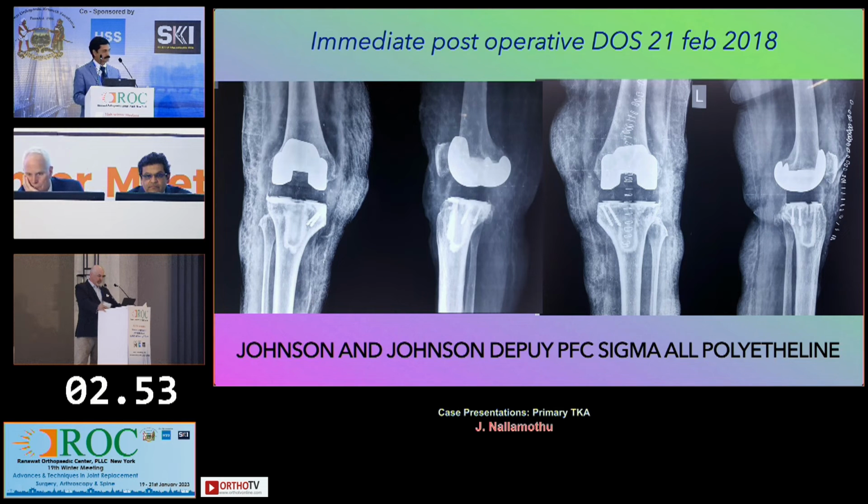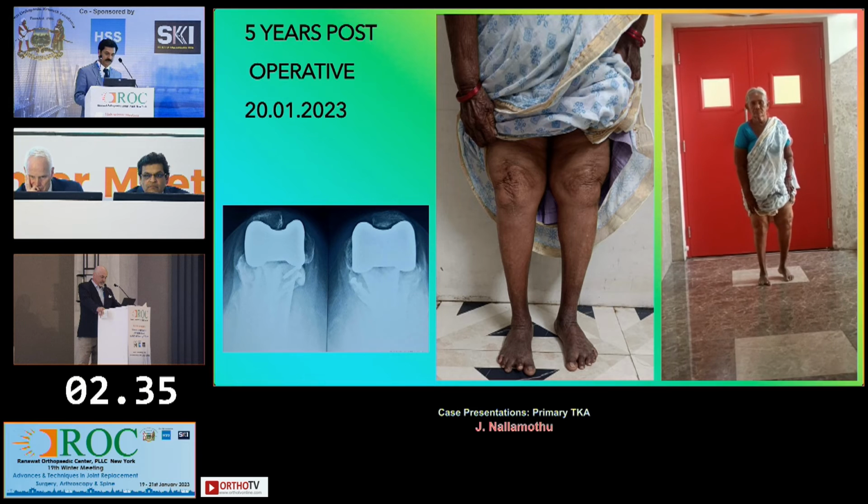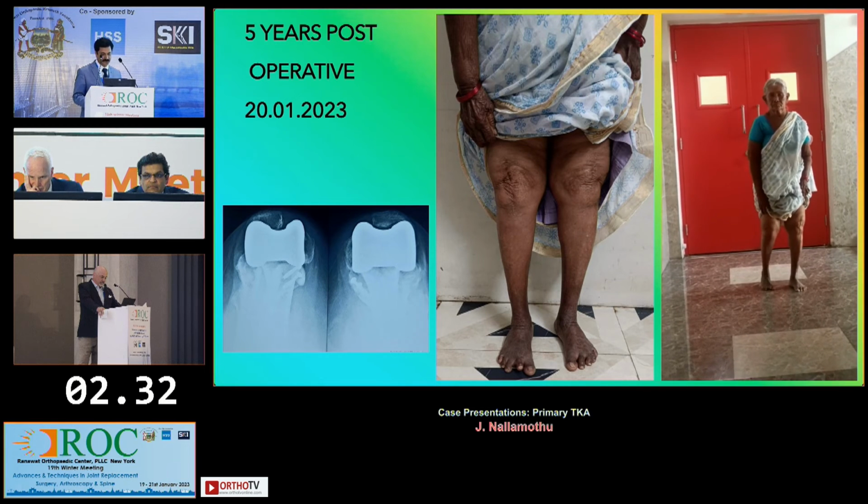I agree. Anybody concerned about the joint line? Patella looks pretty good. Okay. So how did we do? Good. This is the 5 years post-op gait.